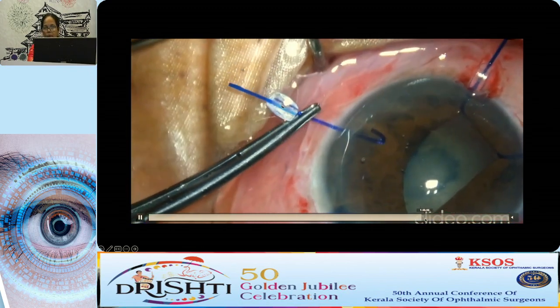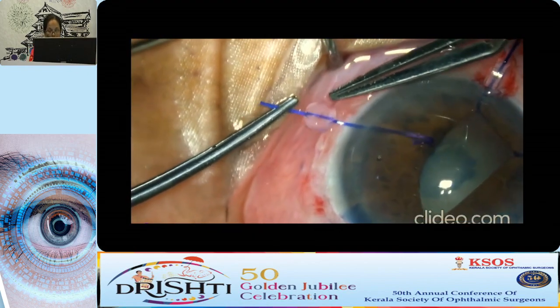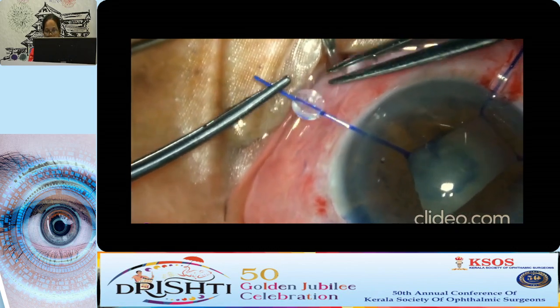You should not stretch the pupil too much, so that it does not cause irreversible damage to the sphincter.